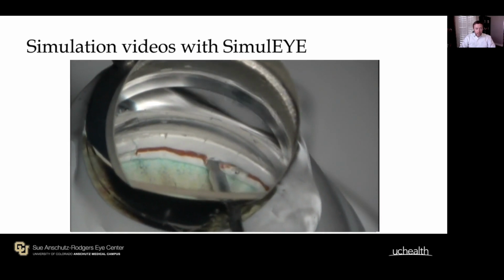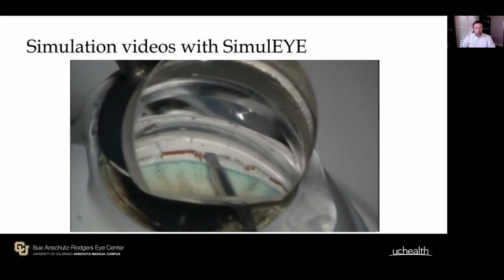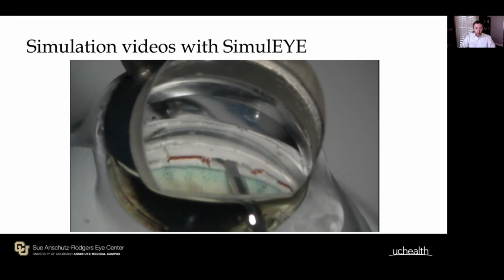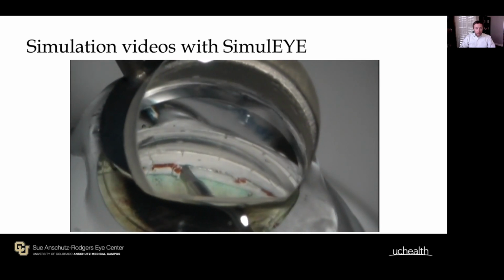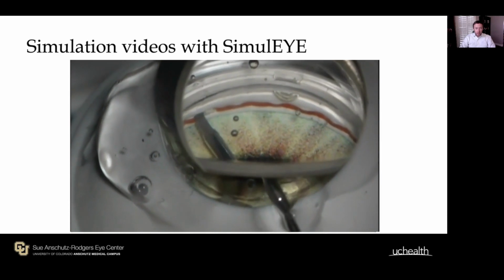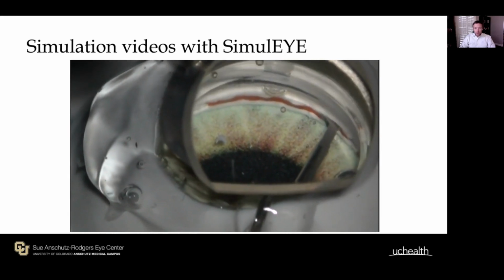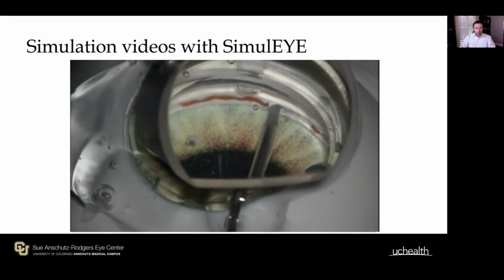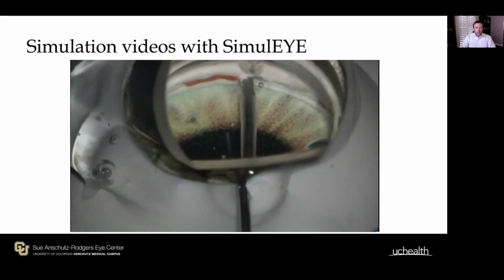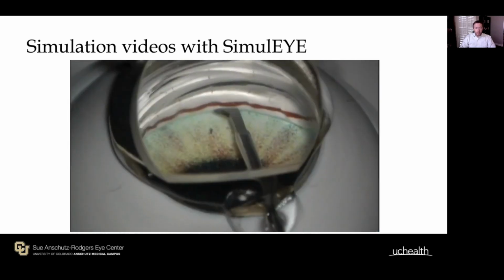Now in a second pass in a different eye, you can see here I get hung up because I'm pushing too hard. The whole eye is trying to rotate. So I back up, reseat, and then I'm able to proceed, not pushing out so far. And here it is again. This is the mark and meet, finally getting it right. So I'm making the initial incision, starting to the far right, and you can't see too much of the ramp, but I'm not getting hung up. I'm at the right depth, and you see a nice gliding and removal of the trabecular meshwork.